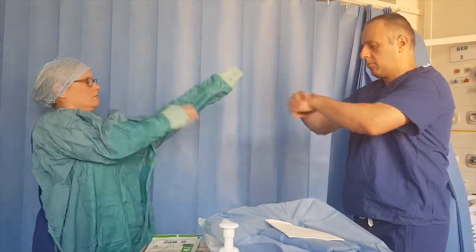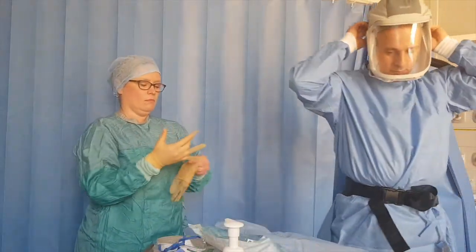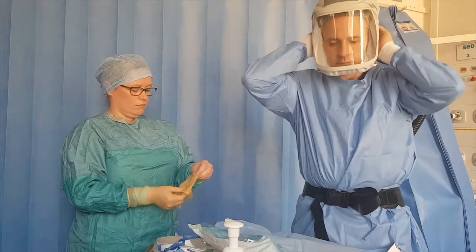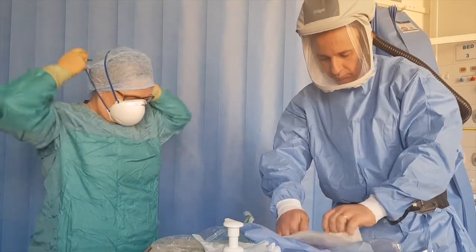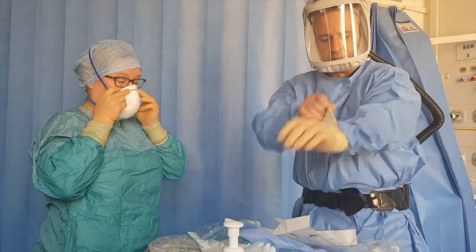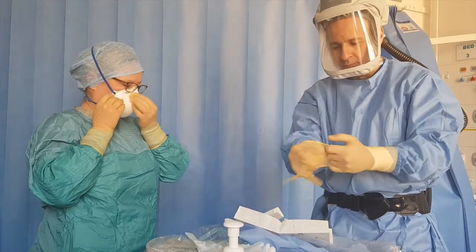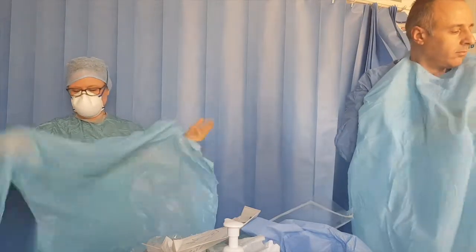When donning PPE, put on the first gown and sterile gloves. Sterile gloves provide better tactile feel than 2 sets of nitrile gloves. Next, put on your mask or respirator. If using a hood, we have found that putting the belt on first, before any gowns, helps later when doffing after admission to ITU. Now, the second gown and non-sterile gloves.